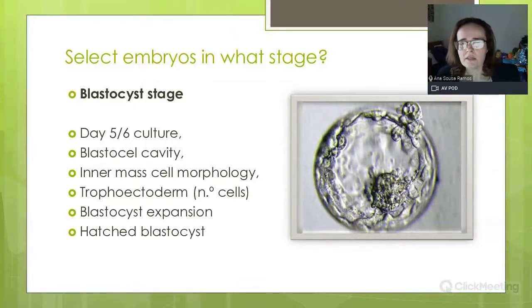And the blastocyst, the embryo at this stage, has an expansion. So through the development, it will increase in size. And usually, in some cases, it has hatched blastocysts. So we have a lot of parameters to select that are included in the grading system.